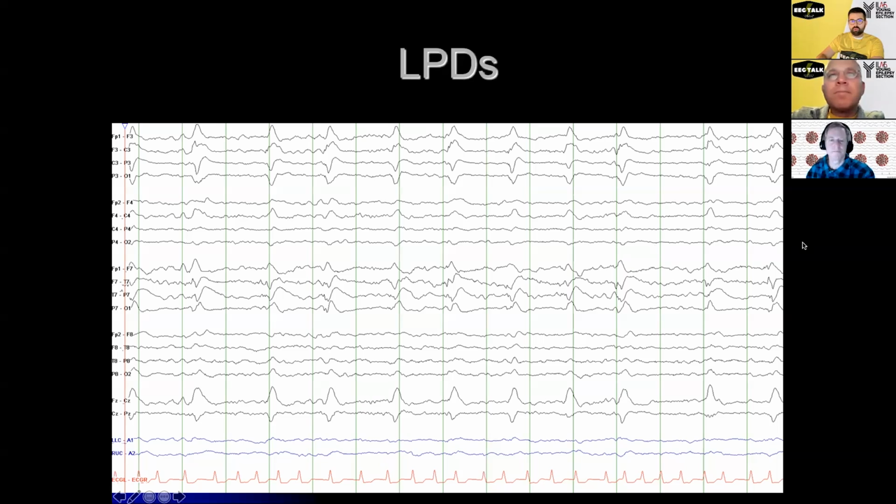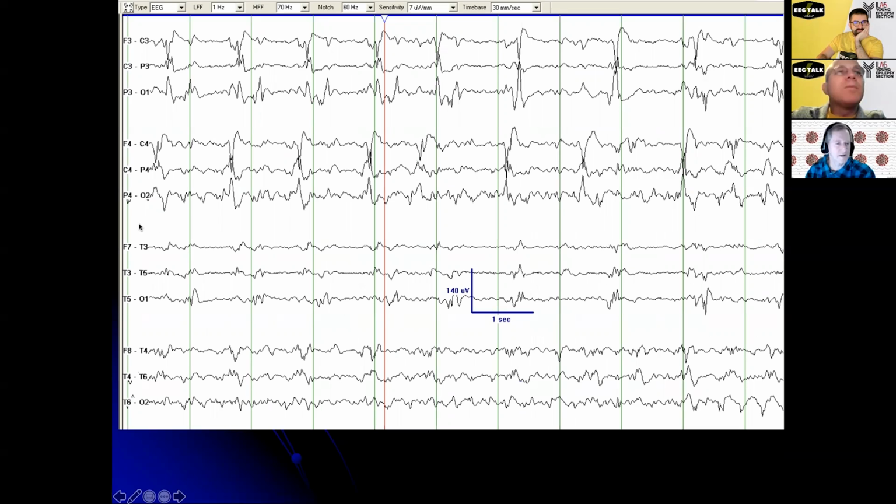All right. So similar montage. We dropped the channel, probably because of artifact. FPs are gone. These are not synchronized. There's LPDs on both sides. But could it be just propagation? I never know if it's actually two foci or it's propagation from one side to the other. That's a great question. Look at this one, for example. Here's one on the right, and it's followed pretty quickly by one on the left. So could that be propagation?